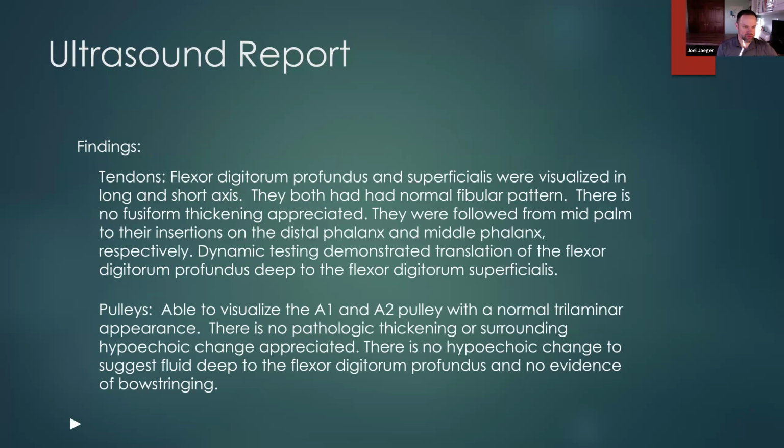Next, we're going to want to go through and describe all the findings. When we look at all these different videos that are done on AMSSM for ultrasound, there's a lot of variance to the different findings. I think the best way to organize these is a way that fits your checklist in your mind, and a way that you're not going to miss anything.